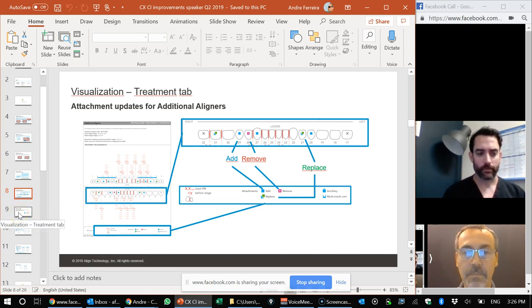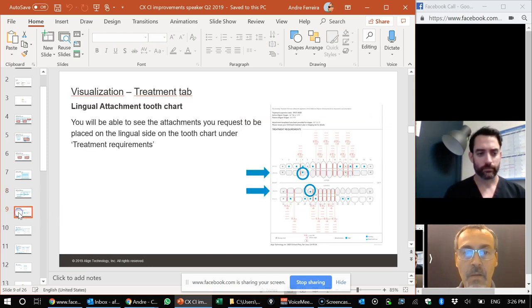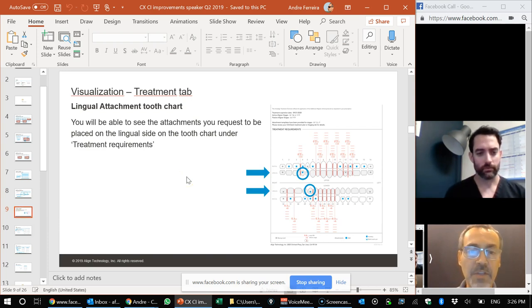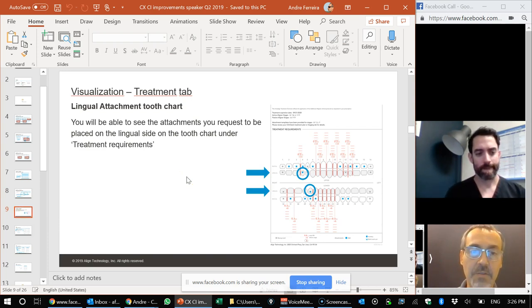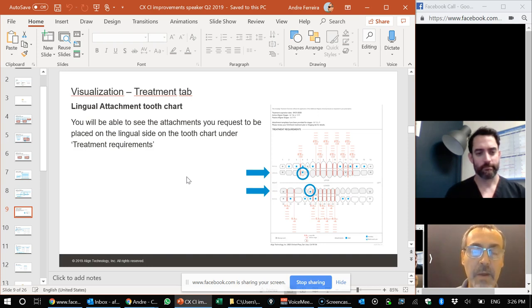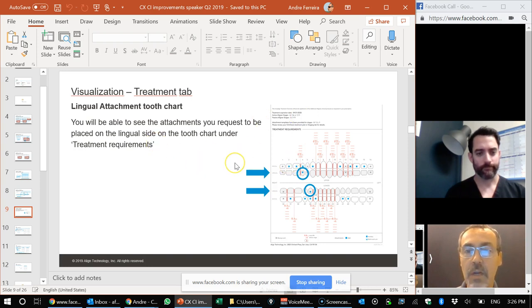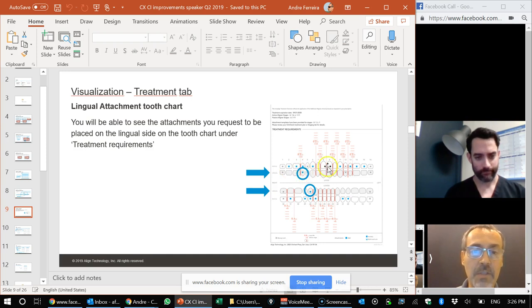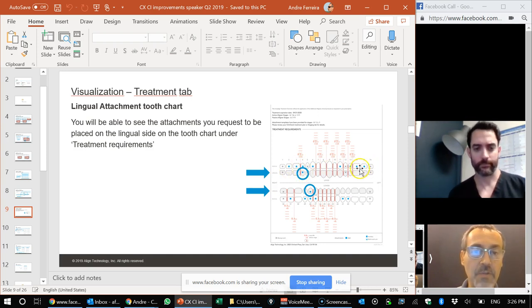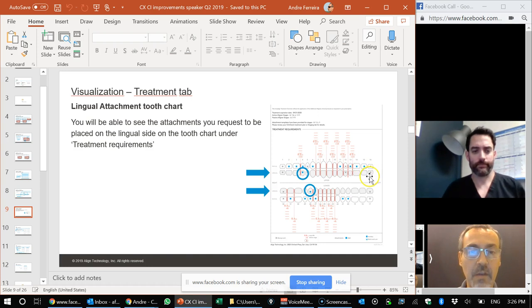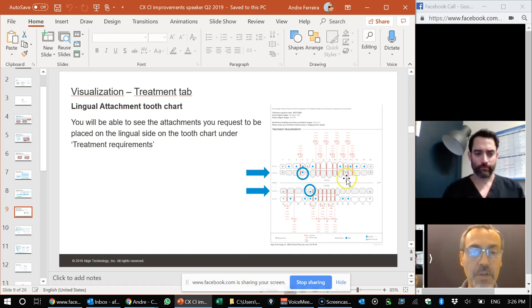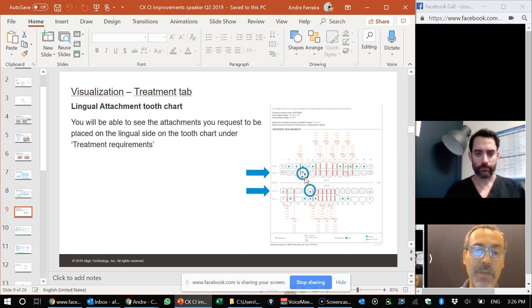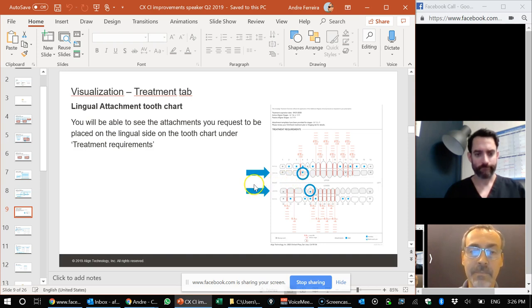In my practice, what we like to do is we just scan this and it's attached to our treatment card. So if we have any questions, we can easily pull that up. This new visualization also on the treatment tab is relating to lingual attachments. So just like any tooth chart, you have the facial surface and on the lower portion here, you have the lingual surface. If you do use lingual attachments, that is a way to catch your eye and make sure that you put those attachments on your patient.